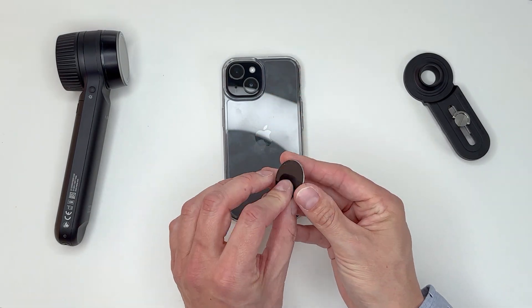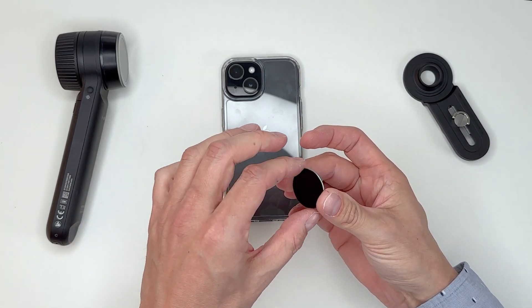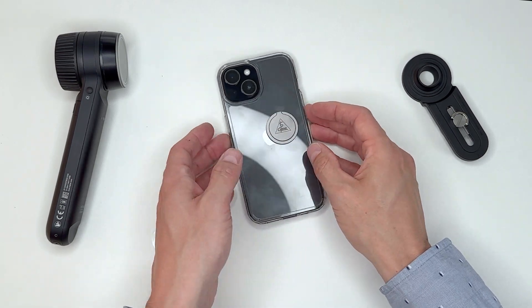Now you can remove the protective film from the fixing button. Attach the fixing button to the phone case and press firmly.